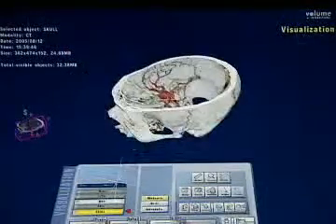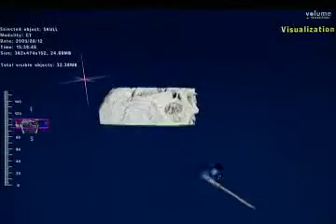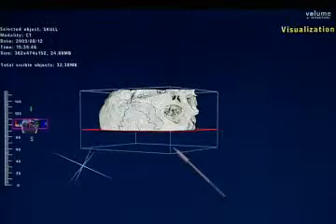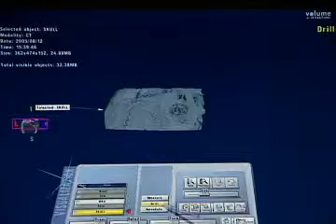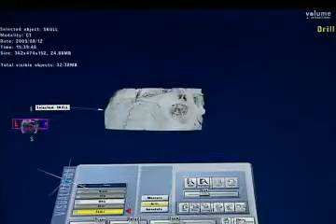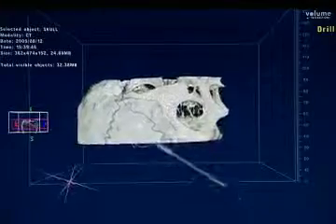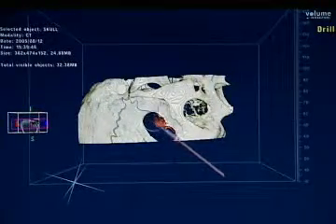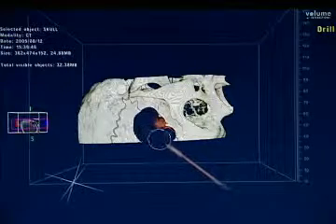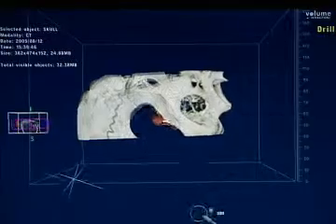And what's nice about this is we could really manipulate it and see whether this aneurysm is clippable even. And I see a lot of aneurysms like this, large aneurysms with wide necks that have perforators or large branches coming out. So here's the way we would approach this. And just doing a small pterional opening.